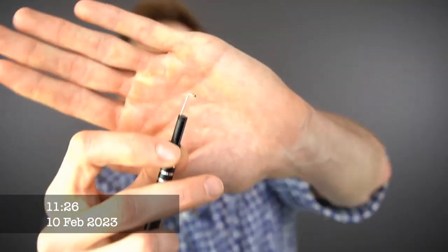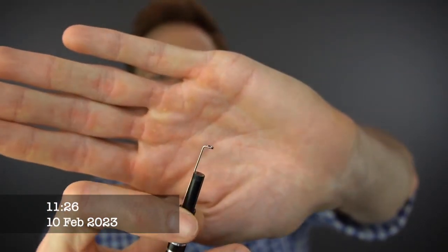The second issue we had is the little metal curette on the end of this thing moves around too much. So when you stick this inside of your ear and you're trying to twist it around to grab the earwax, it just gets really flimsy and it makes it to where you really can't even grab that earwax. It is hard enough to pull earwax outside of your ears using the proper instrumentation that is very sturdy, but when you put a real flimsy piece of metal on the end of a video endoscope, it doesn't work so well.